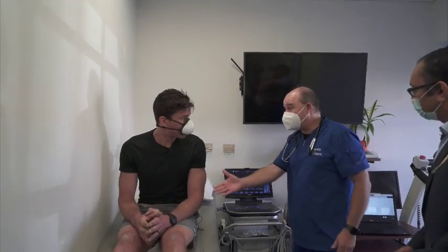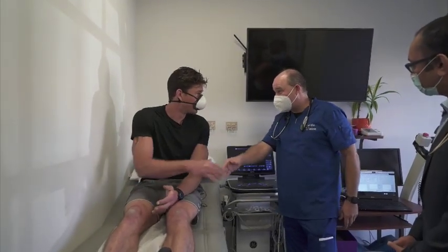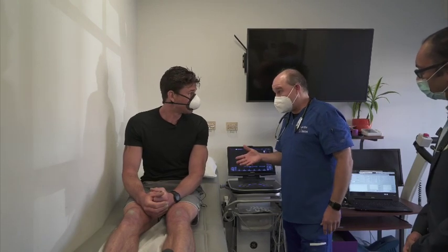My name is Michael Crowley. Good to meet you, Michael. Nice to meet you — with CardioVision. So we're going to be doing your ultrasound today.